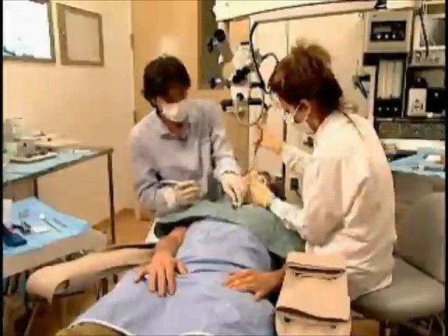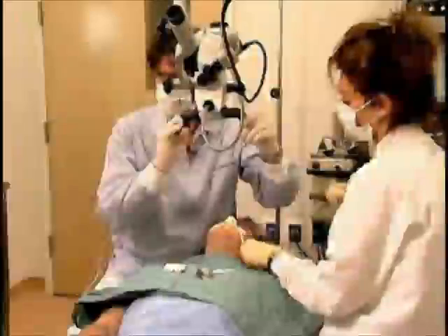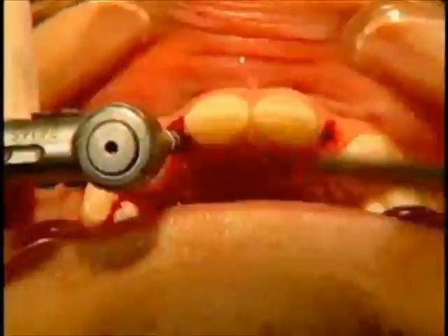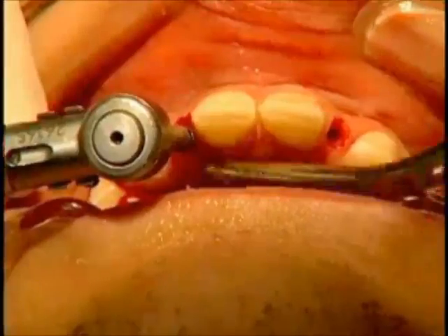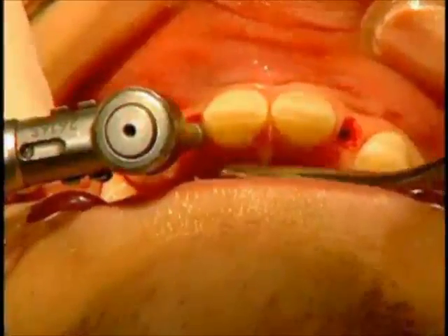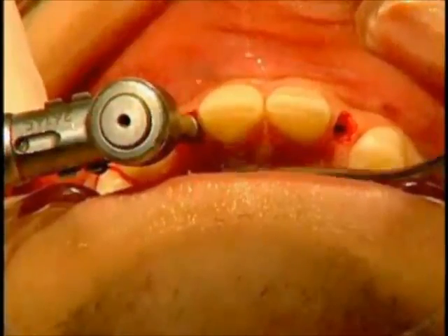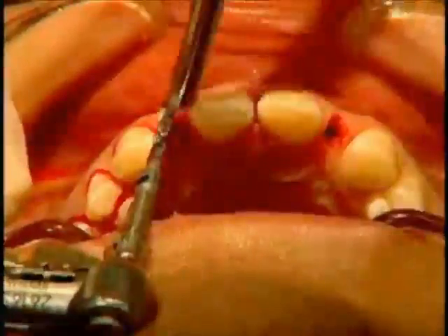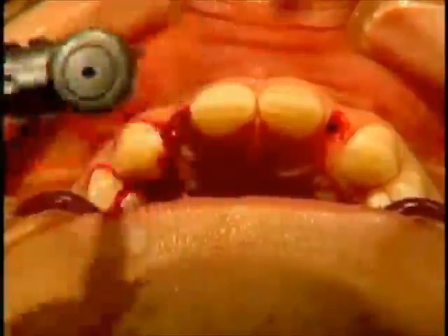Do you have some more anesthetic? Okay. The length we need to have is 3 millimeters subgingival, so we don't have any problems with the restorative. And that's why I need to put an extension. What you're seeing now is the extension, so I can get the proper length. You can see again all the bone that Laurie's suctioning up. We're going to use it again once we're done with the drilling procedure. And then again on this side.